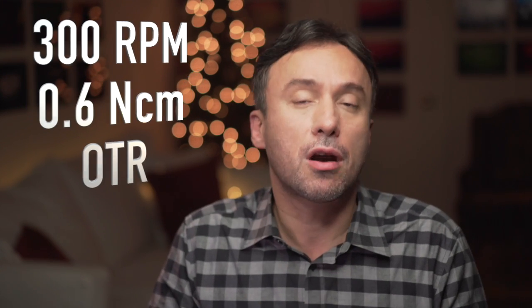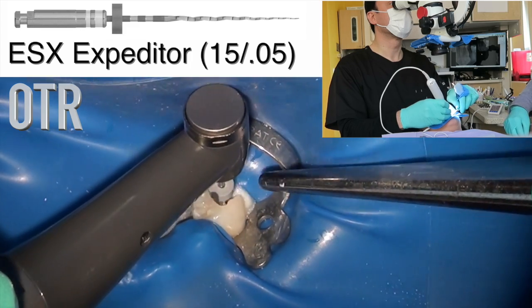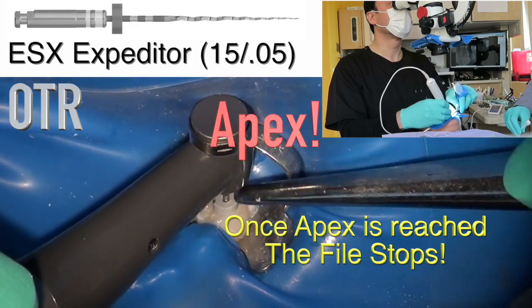I recommend using the handpiece in three specific phases. In phase one — getting down to the apex after axis preparation — I recommend 300 RPM with a 0.6 OTR setting. During phase two — measuring working length — you connect the handpiece to the apex locator, the Endosync AI, and use 300 RPM with 0.6 OTR and apical stop, meaning whenever the file reaches the apex and the apex locator signals the handpiece, the file stops.